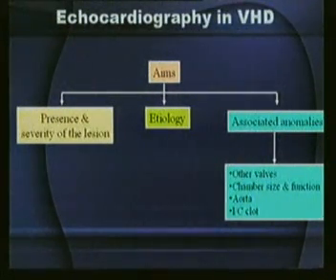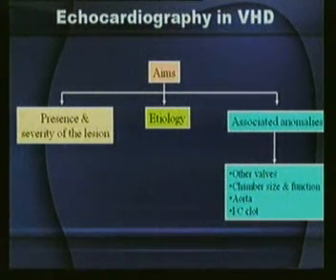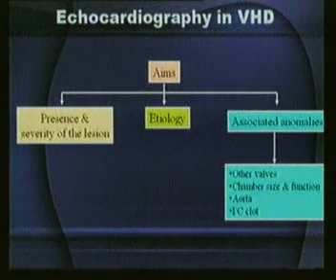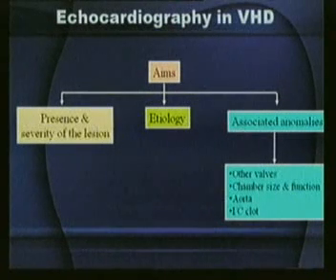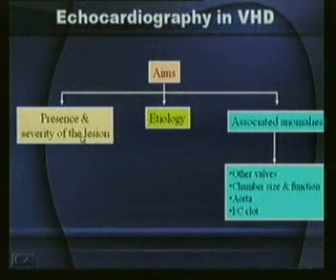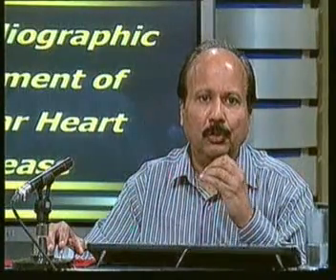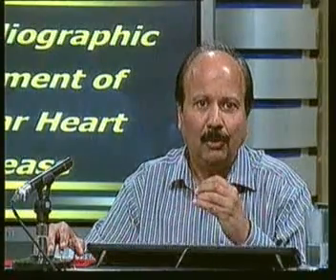As my colleagues will tell you, when you are dealing with a case of aortic stenosis, for example, if the LV function is on the lower side, if there is LV dysfunction, the gradients that you have got will be fallacious, and you will have to interpret them in the light of the LV function. So that's again extremely important. And then, of course, you will be able to find out the severity of the lesion. So not only will you find the presence of the disease, the diagnosis of the patient, you will also know the severity of the lesion or the lesions.